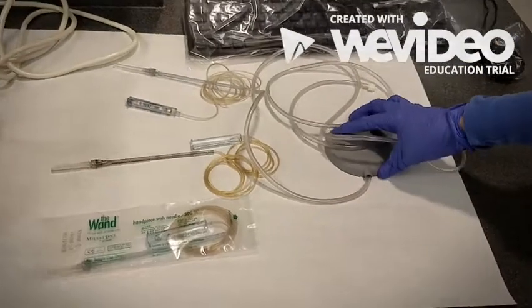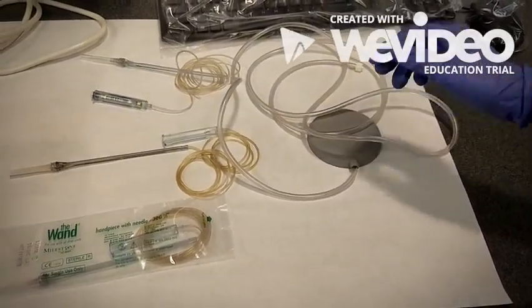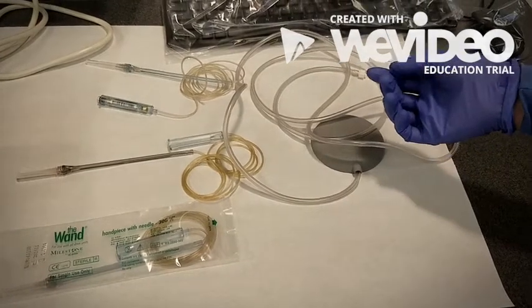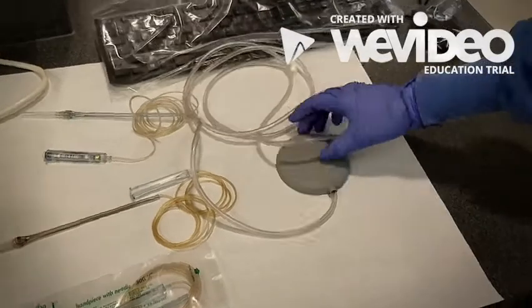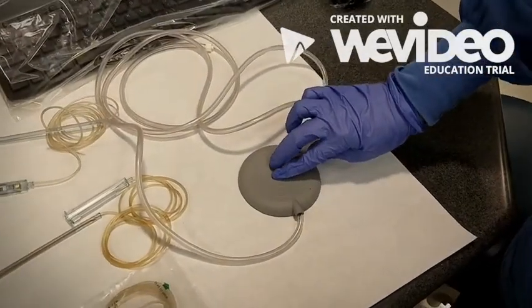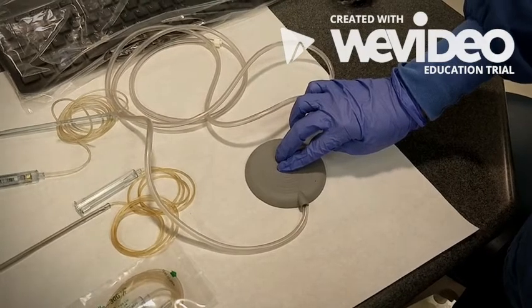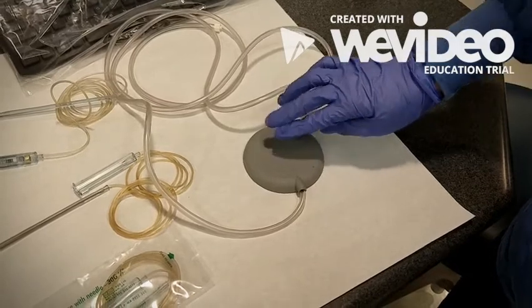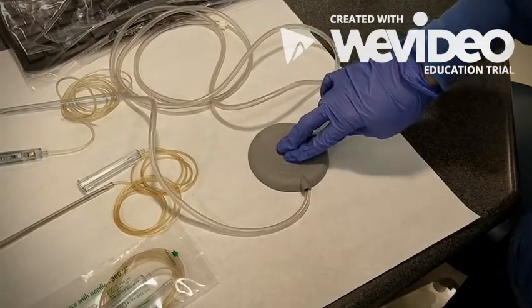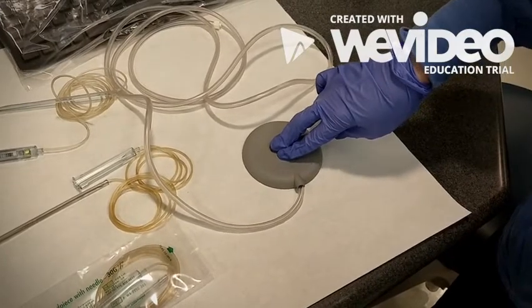The foot control activates the unit and controls the two flow rates, fast and slow. Maintaining an ideal flow rate is probably the major factor in achieving a more comfortable injection. The slow rate, when we just barely depress it, delivers 1 drop every 2 seconds. Each drop contains the same amount of anesthetic. At that rate, it takes approximately 2 minutes to deliver a full cartridge. The fast rate, when we depress more heavily, delivers a steady stream, and at that rate, it takes about 1 minute to deliver a full cartridge.